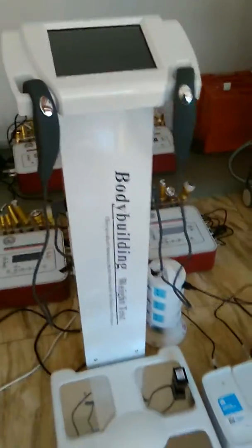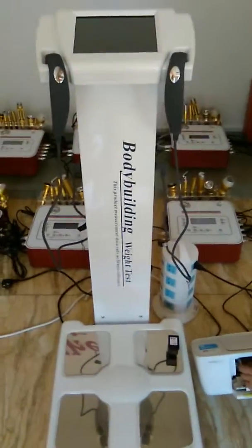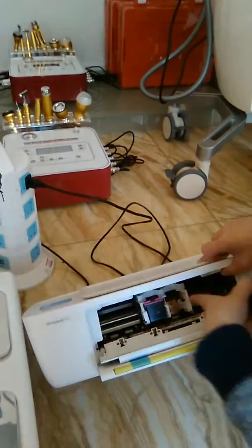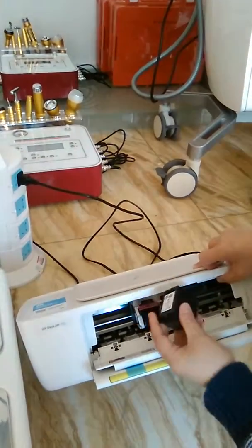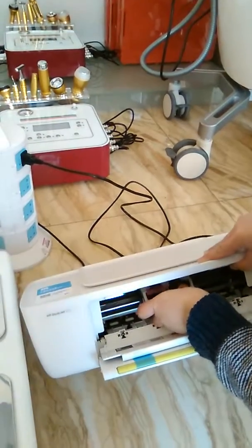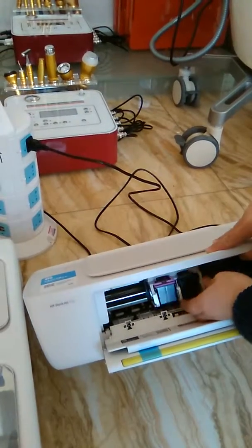Now I will show you how to put the cartridge into the printer, and how to pull it out.